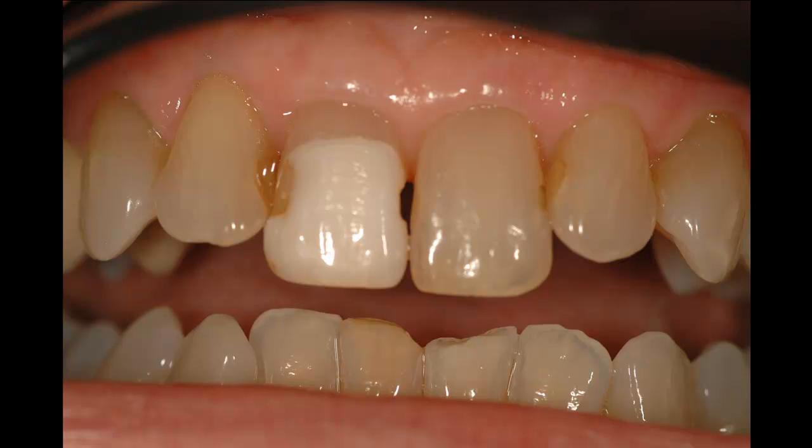So we obliged and just set it right back on there, not telling her that it's just desiccated and some color will come back. But she thought that was pretty ugly, and she didn't want to be seen looking like that. But we felt that might be a good thing to use. Maybe we should do this as a biocopy case and use that shape and form to create the crown and make the restoration look as close to natural as possible.